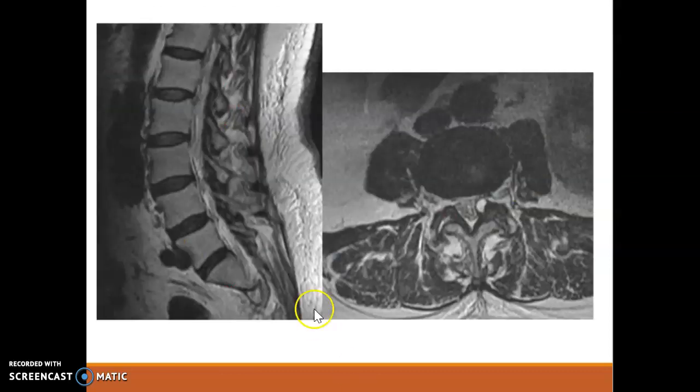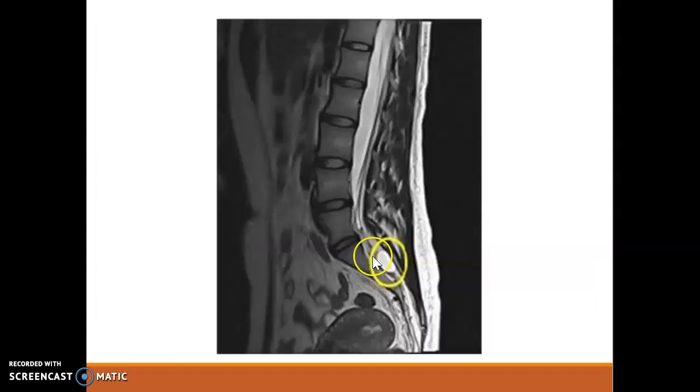Okay, and then looking forward, you can see even just by a rudimentary look over some of the MRI scans that there are areas that potentially you would want to look at in more detail. So it's being able to look down that MRI scan and perhaps scroll through when you're circling on something that doesn't seem quite right, and you might want to investigate that in a little bit further detail. Whether that be on a T1 sequence or a T2 sequence, or you see something really quite bright white that doesn't seem to fit with anything else, you want to be investigating that. Is that a tumour? Is that a cyst? Again, you don't need to make that diagnosis, but it's being able to notice that there's something that's not quite right.